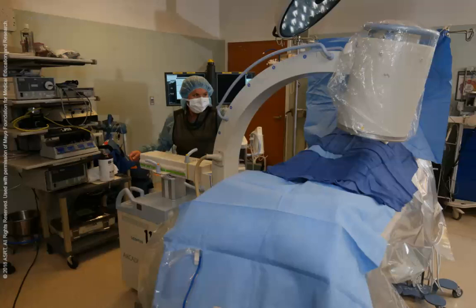The divergence of the X-ray beam from its source has less radiation per unit area, so increasing distance decreases radiation exposure. Maintaining as great a distance as possible from the source of radiation is the easiest form of radiation protection, especially during fluoroscopy. Because the most common source of exposure to medical personnel in fluoroscopy settings typically is scatter radiation from the patient, personnel also should maintain as great a distance as possible from the patient during acquisitions.